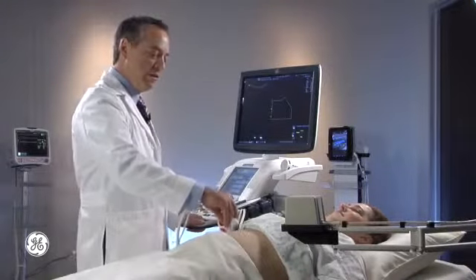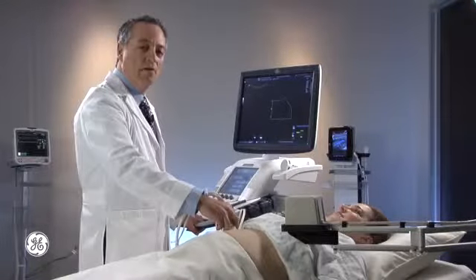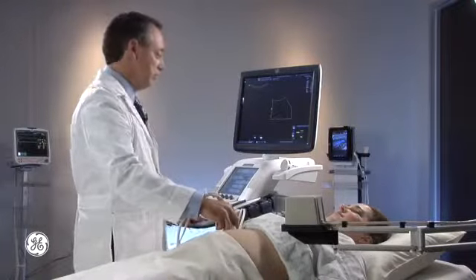The first is a target marker. Target allows you to mark one specific area and show as it's advancing through the anatomy. Maybe it's as you're seeing a needle tip, as the needle is progressing.